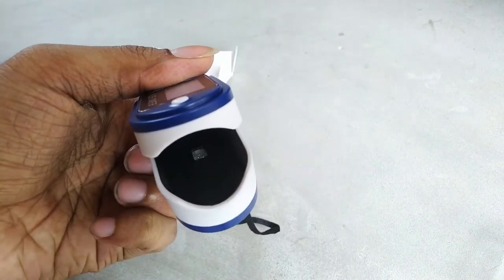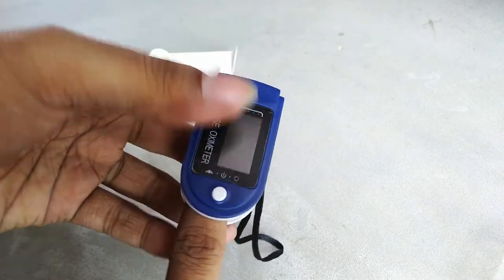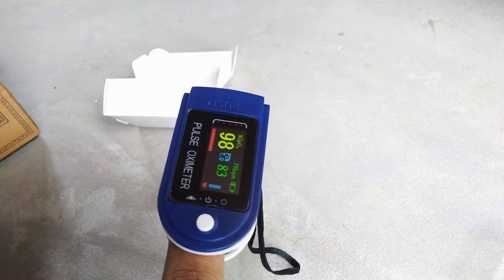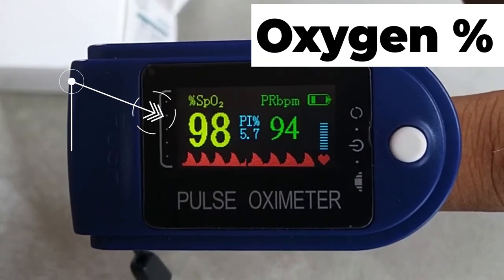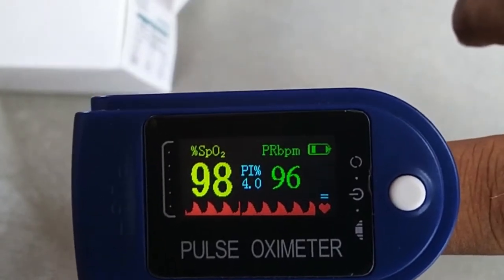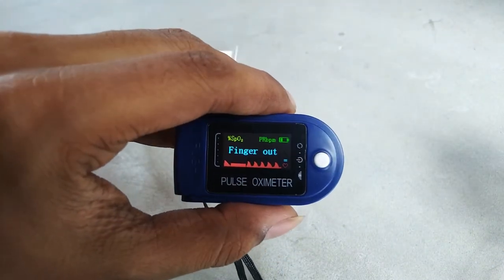If you put your finger in, it will stay switched on as long as you want. You can see a red light blinking from the finger area. Remember, you should insert your middle finger — not the index finger — to get the optimized result. On the screen, the top left shows oxygen saturation level in yellow, the right side shows beats per minute, the middle shows the PI index, the bottom right shows battery level, and the bottom shows a heartbeat curve graph.